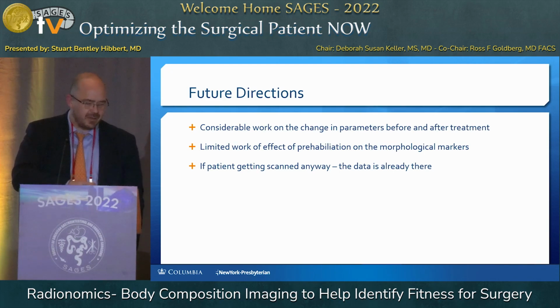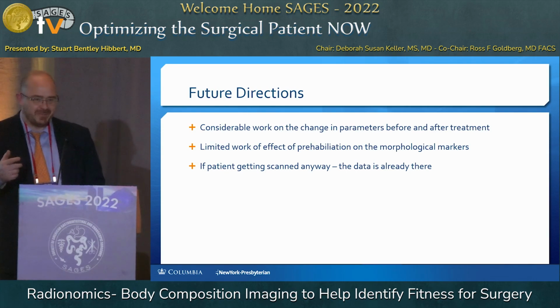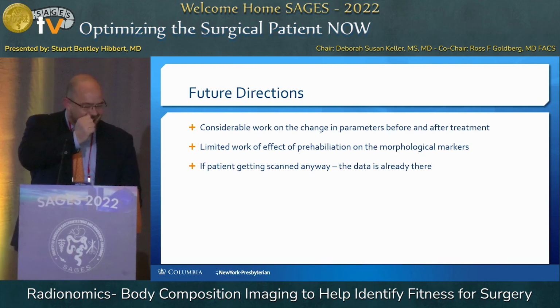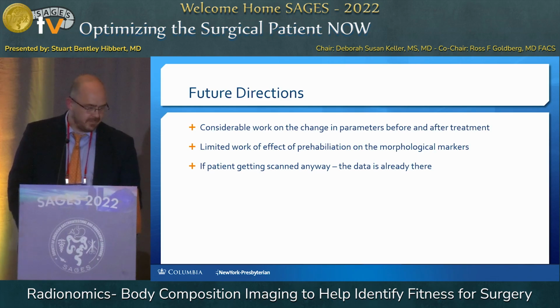Very little work has been done on prehabilitation using these morphological factors. Is the stuff that we're doing to optimize the patient for surgery actually making a difference in that patient? Now, if you are doing prehabilitation, which I'm saying three times because I actually looked up the word three months ago, I'm a radiologist, I don't go to the gym. If the patient is getting scanned anyway, use the scan to get the data. And hopefully within the next short period of time, this will be routinely clinically available.